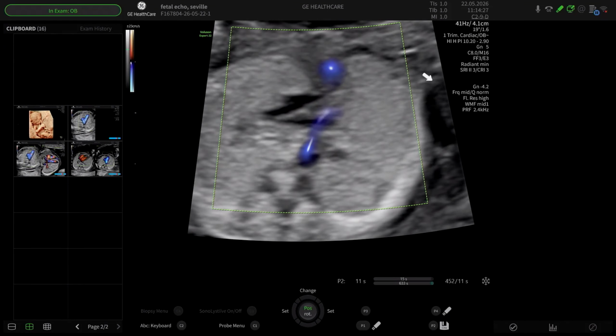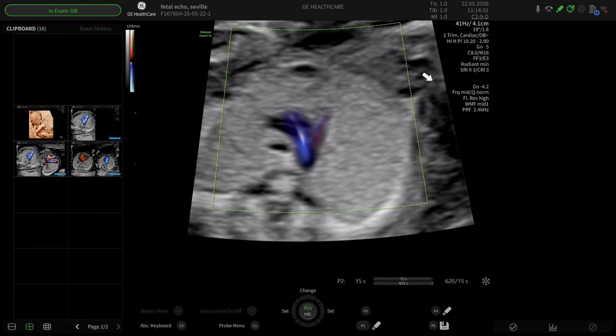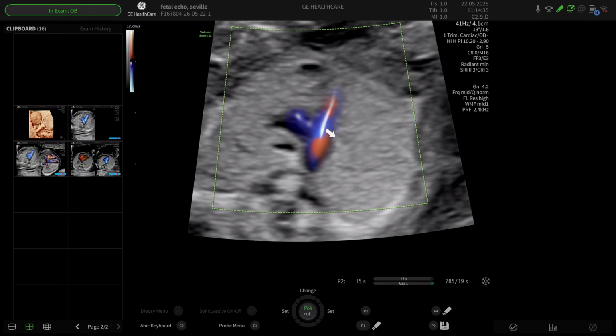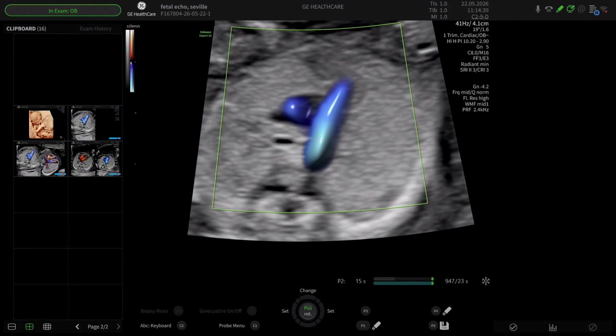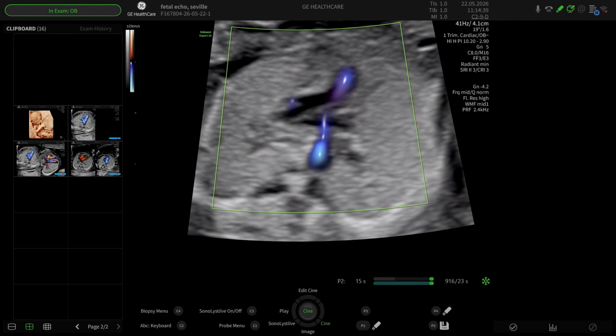And then I sweep up to the three-vessel tracheal view, demonstrating those arteries. I don't know if there's any questions that anybody wants to ask from the audience as I go along here, but as you look at this is the trachea and I head down, you can see the trachea then branching into right and left main bronchus. So if you look on here, this is the right main bronchus here, and this is the left main bronchus. If I come back, you can see it there.